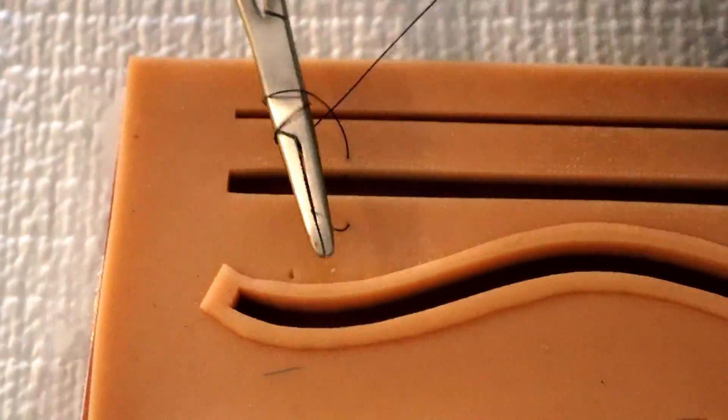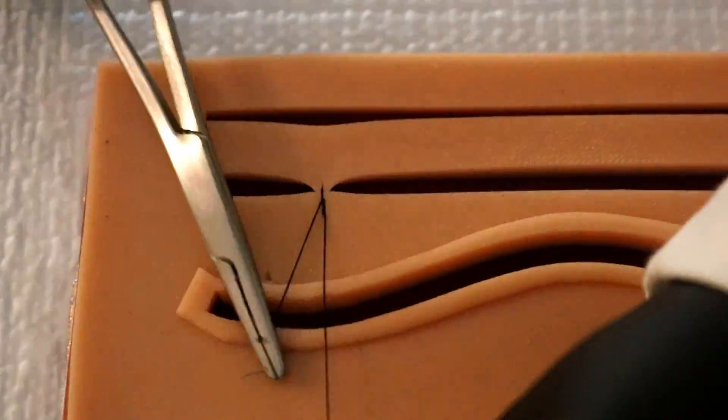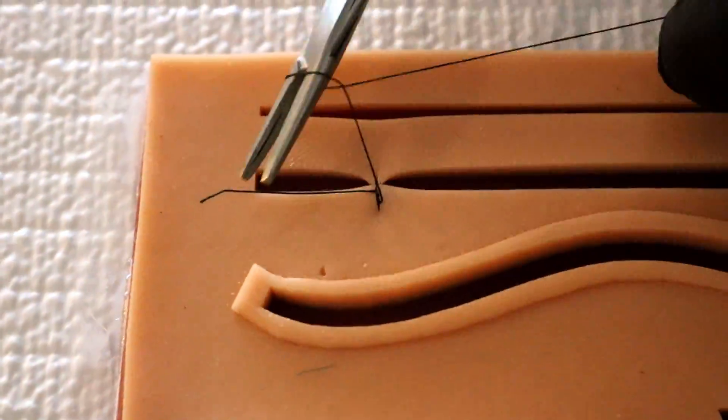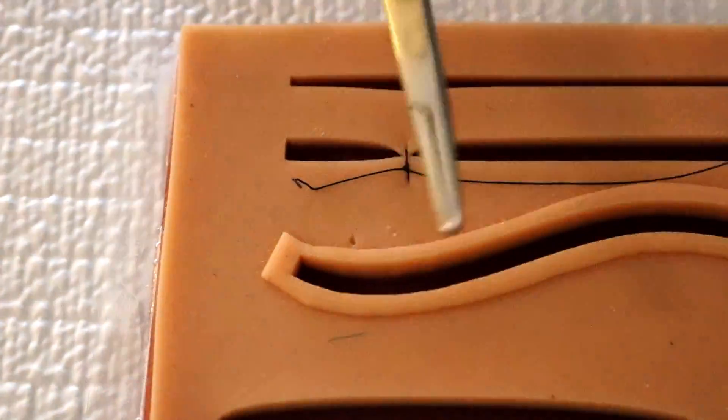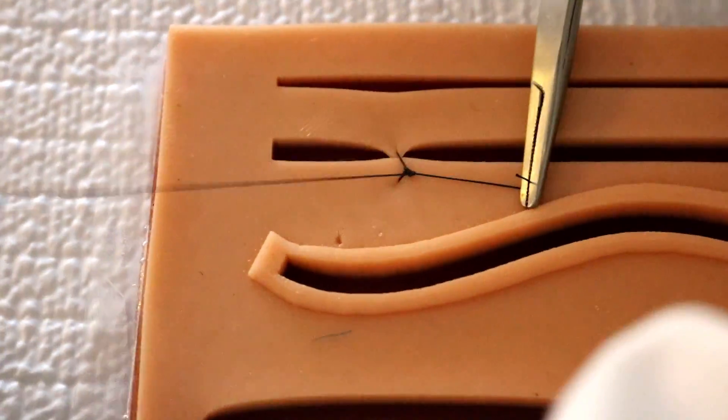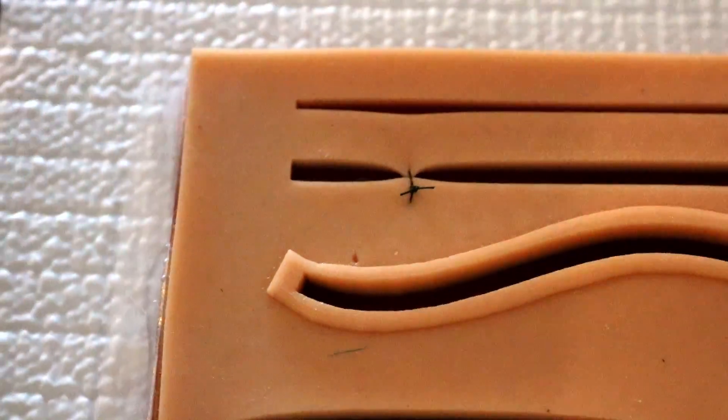Here you can see a simple interrupted suture being placed and once again we'll go over it in depth. Just watch this little sped up video here. I think it's a pretty good placement looking pretty good so let's begin.